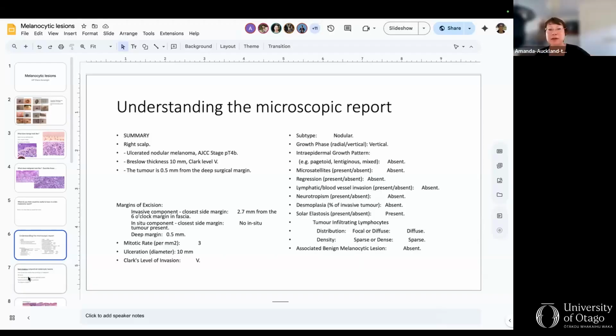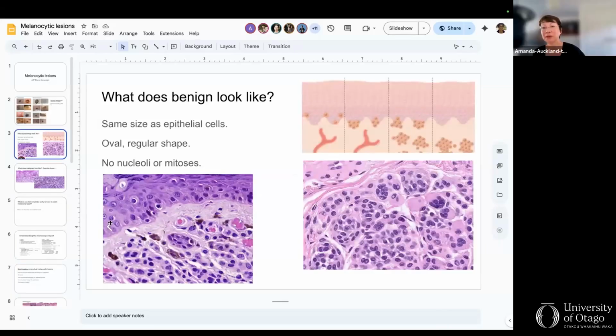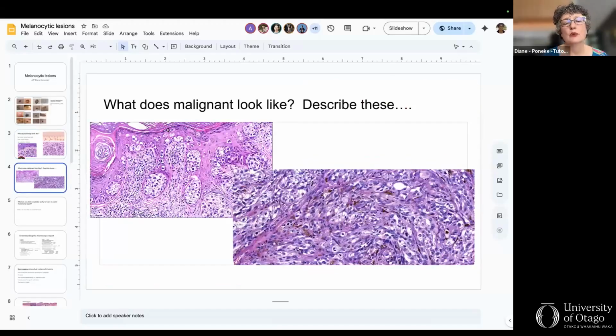Okay. So there's a word here that people find confusing. It's called lentiginous. What does that mean? Maybe you could bring back number 3, that might be a good one to show it on. Yeah, so lentiginous spread, like in lentigo maligna, just spreads along the base here, adjacent to the basement membrane. And you can get melanomas in situ that just spread along the base, as opposed to that one that we saw earlier, which was a melanoma that was spreading upwards with these nodules.